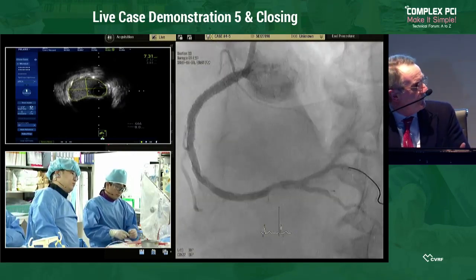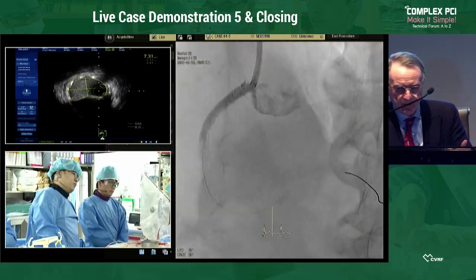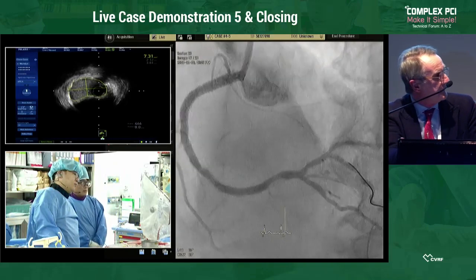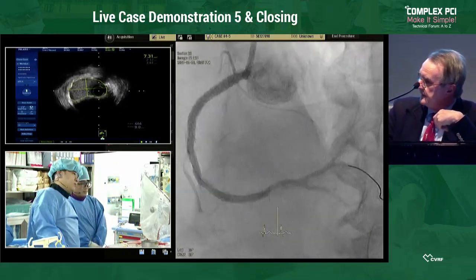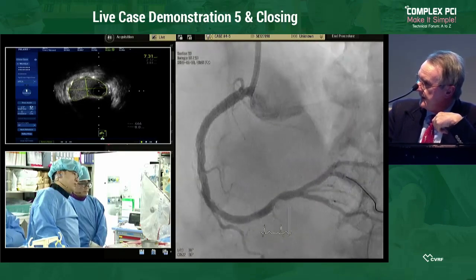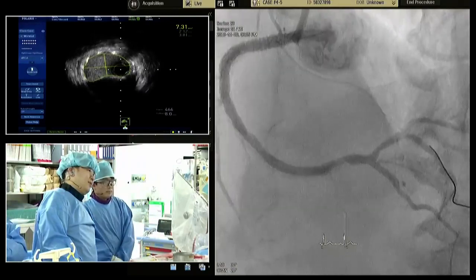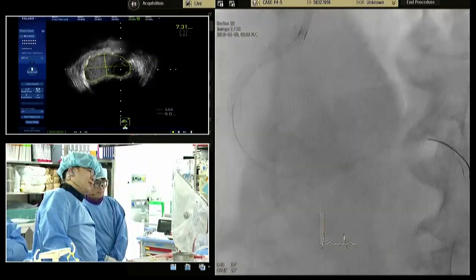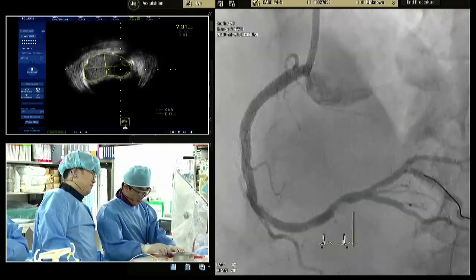It's a 3.5 vessel. It's a big vessel. You don't want to leave such a long series of stent with an outflow. You mean you don't need an FFR? No, just a short stent. Antonio told you, right? It's a 3.5, it's not a big deal.